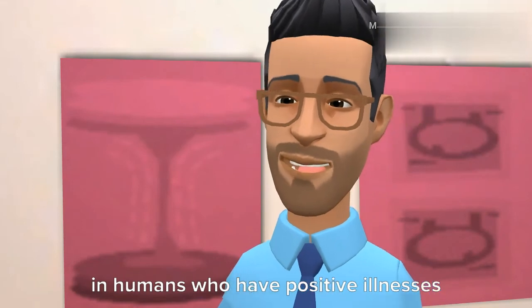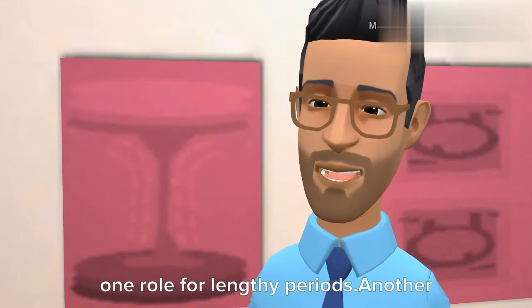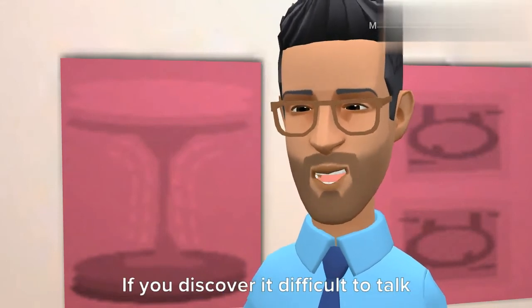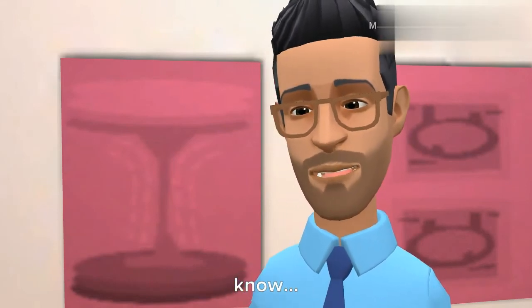Using a ventilator also can put you at risk for blood clots and serious skin infections. These problems tend to happen in people who have certain illnesses and/or who are restricted to bed or a wheelchair and need to stay in one position for long periods. Another possible problem is injury to the vocal cords from the breathing tube. If you find it difficult to talk or breathe after your breathing tube is removed, let your doctor know.